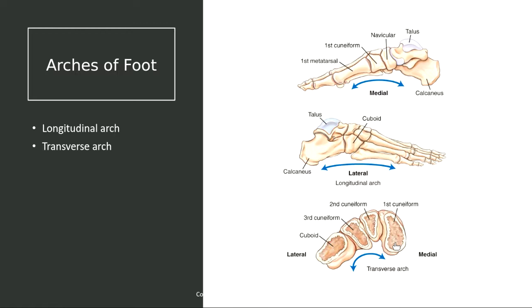But the one we typically look at, especially when we do central ray on AP foot, you tend to want to evaluate the patient's longitudinal arch from the medial aspect. Okay, so that's the one we typically look at. And this is found on page 215. Everything we've looked at so far has been found on either page 212, 213, 214, and this is on 215.